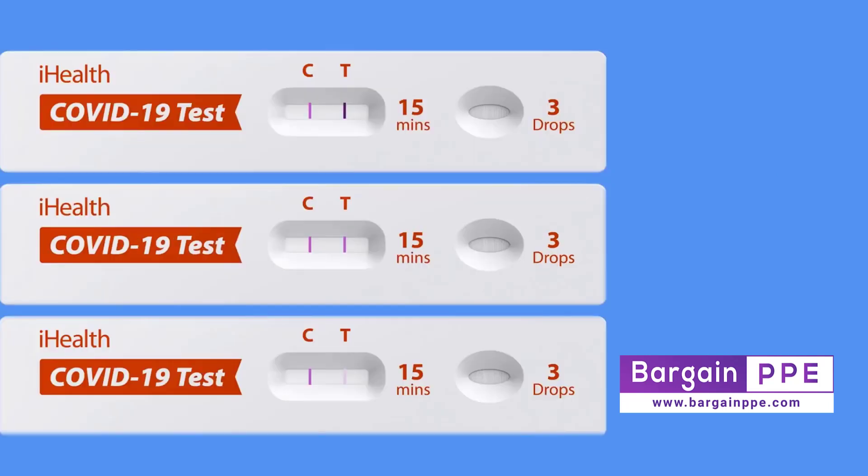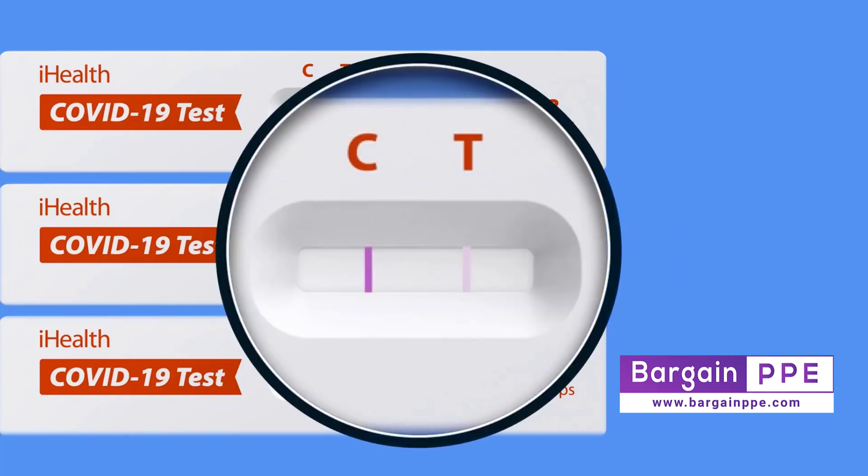Be aware that depending on certain factors, such as how long the virus has been in your system, the line under the T may be very faint. Regardless of how light or dark, any line at all under the T means that you have tested positive for the virus. If you're unsure, you may wish to use a magnifying glass or hold the test card under a bright light for closer inspection.